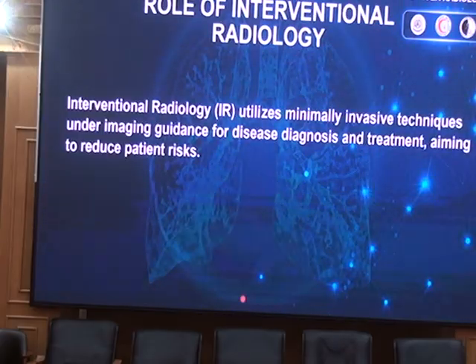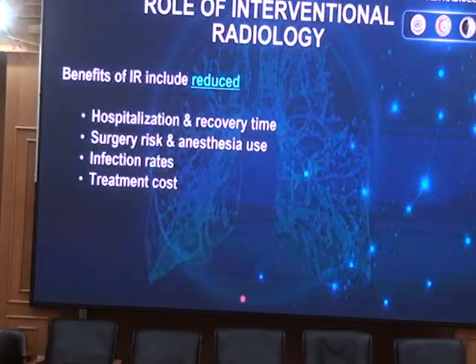Interventional radiology utilizes minimally invasive techniques. It helps in both diagnosis and treatment of lesions. Benefits of interventional radiology include reduced hospitalization and recovery time, reduced surgery risk and anesthesia use, reduced infection, and reducing treatment costs.